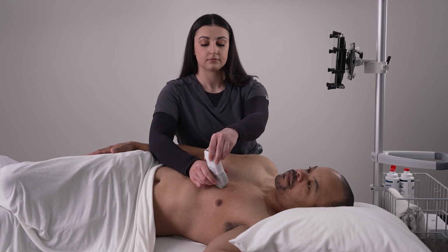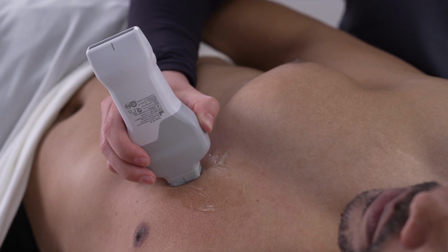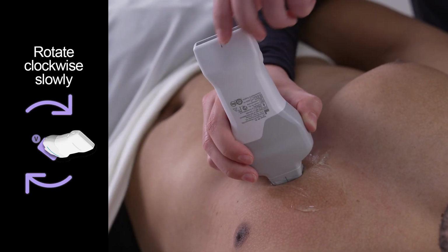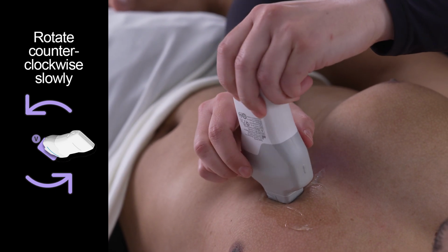Rotate is another guidance prompt. Since it is a fine movement, make sure to stabilize your wrist and hold the probe close to its face for maximum control. The 2 directions for rotating are clockwise or to the right, and counterclockwise to the left.